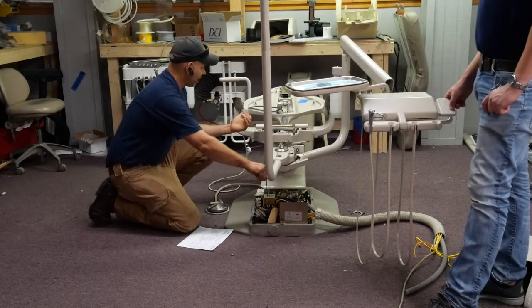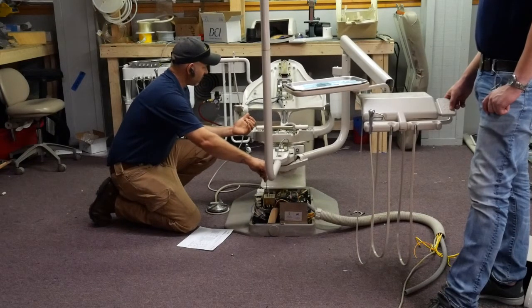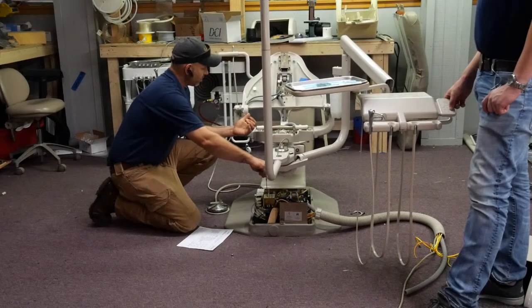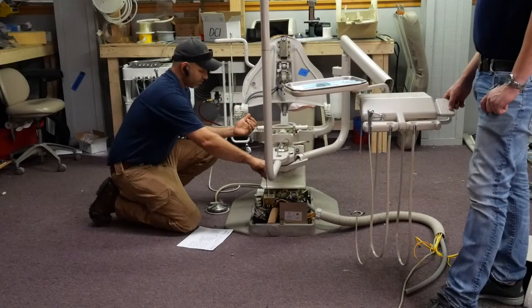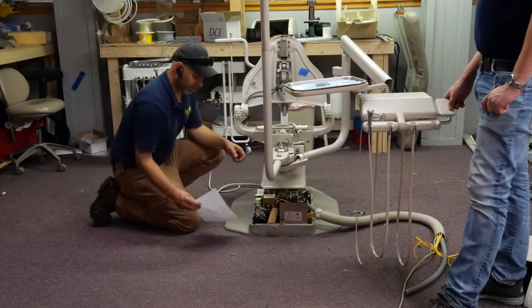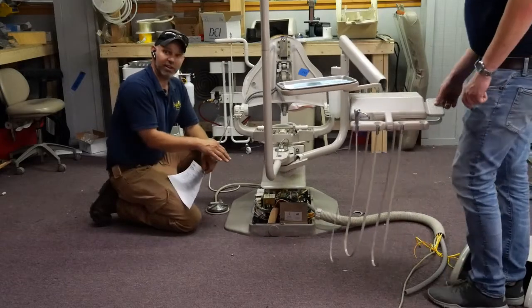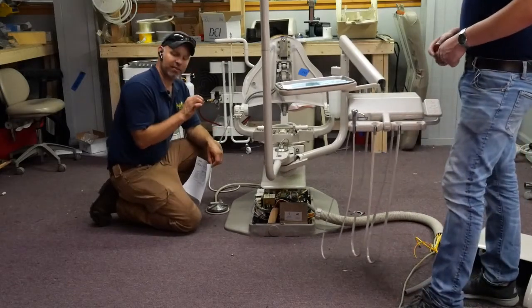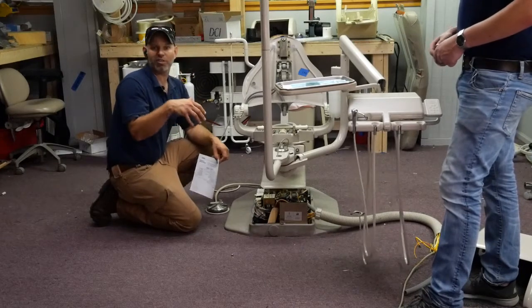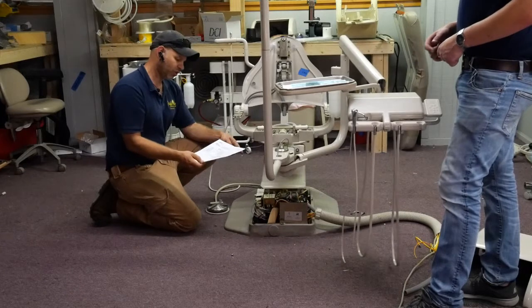Now go ahead and do the back up, and then we'll turn that. Okay, see how I can slow that down a lot? All right. Now, something to keep in mind is that while you're making this adjustment, there are some things in here that can hurt you. So definitely, I would make this adjustment with the power off. We've done it with the power on for the benefit of you seeing how the chair control works.